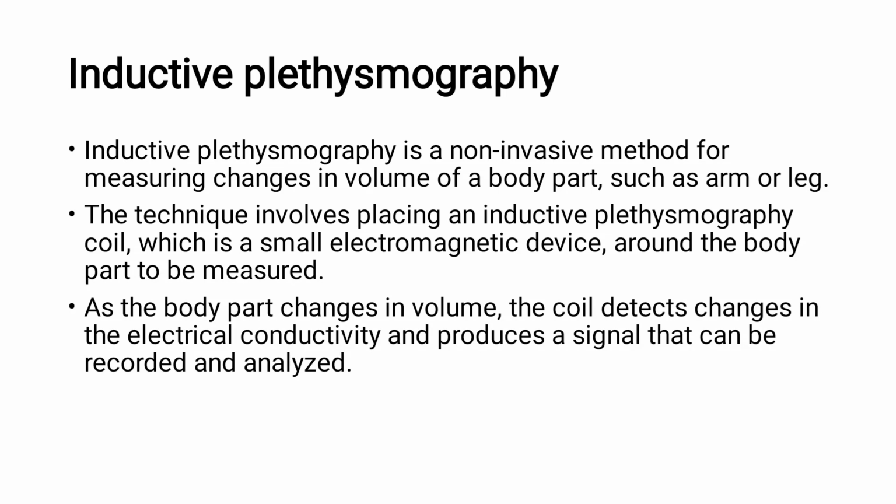In this presentation, I am going to explain the plethysmography types, then pneumography, then ground force sensors, ground reaction force sensors. First thing is inductive plethysmography.